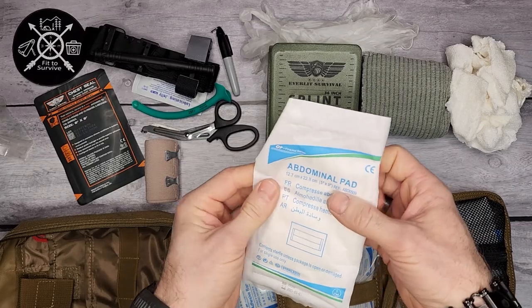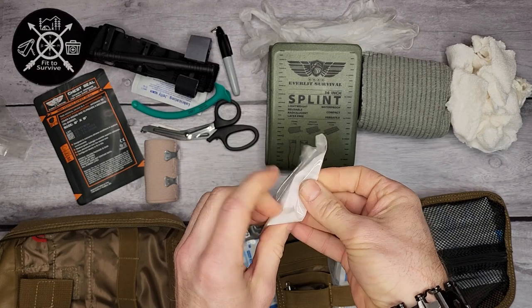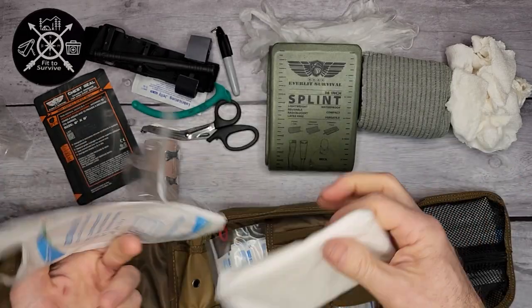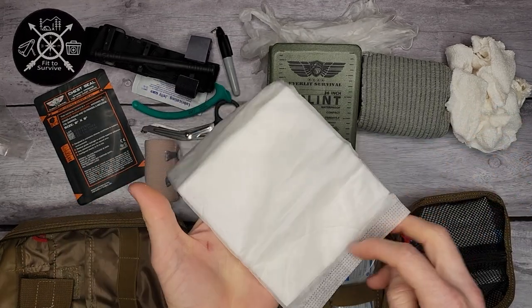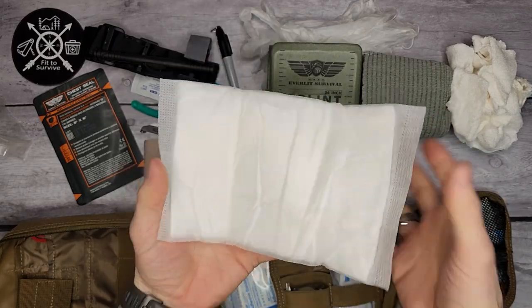They also have an abdominal pad — a smaller-size one. It's just a pad for applying to a wound, and it's actually fairly large.